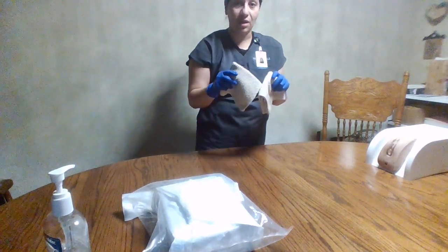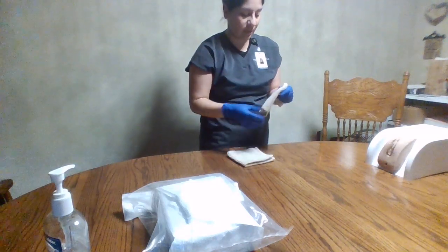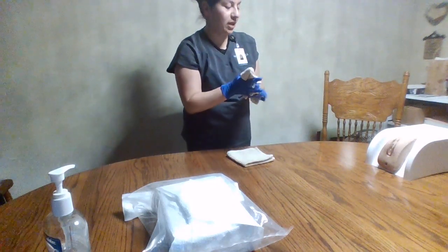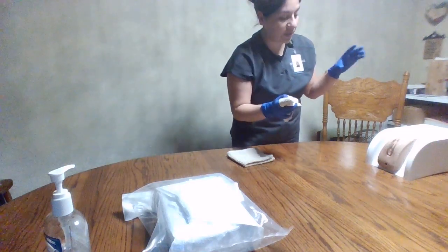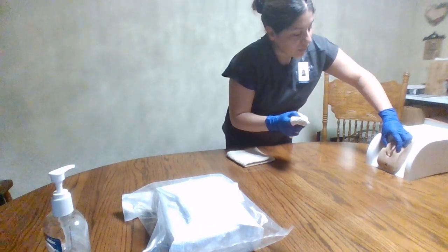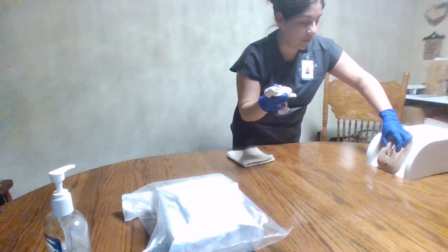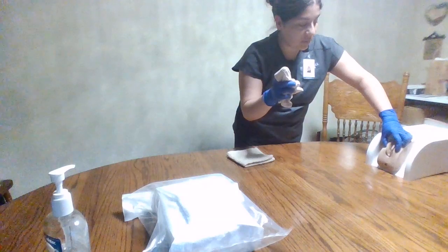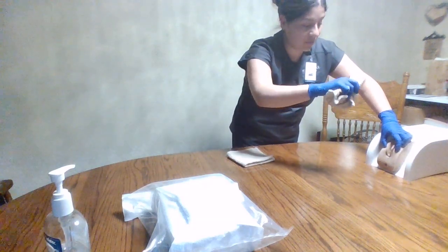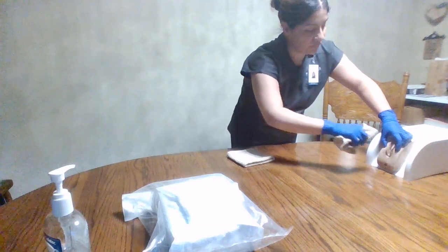I do have two towels, one for the no-rinse soap and one for drying. And once I have the patient's permission to touch, I will begin. Okay, Mrs. Smith, I am going to touch you. All right. So with the no-rinse soap towel, I will begin with the labia furthest from me, starting from top to bottom and going in a downward position.